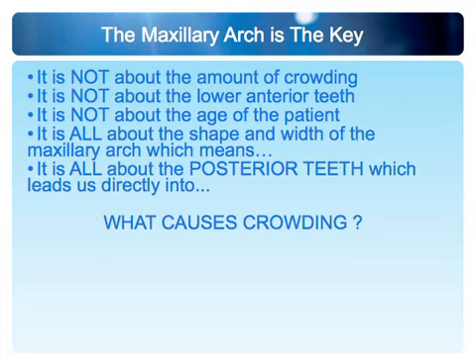When the maxillary arch can be developed, the lower arch will follow it. The lower anterior teeth will have a place to unravel into. So it's a sequence of events that gets us to those lower anterior teeth, and not necessarily just getting in there and doing IPR on the anterior teeth and trying to spin them into place. That's not my favorite technique.